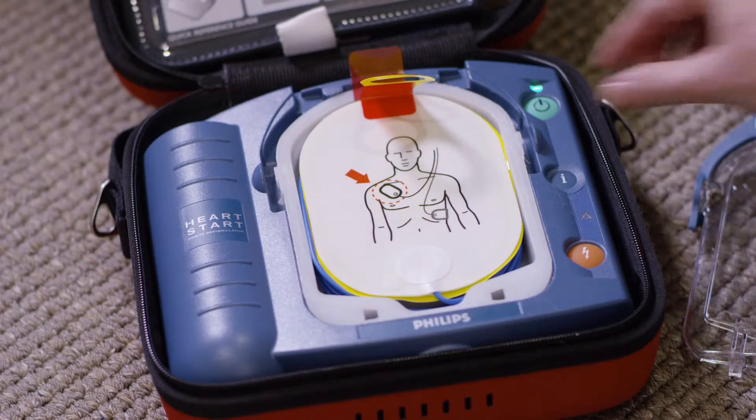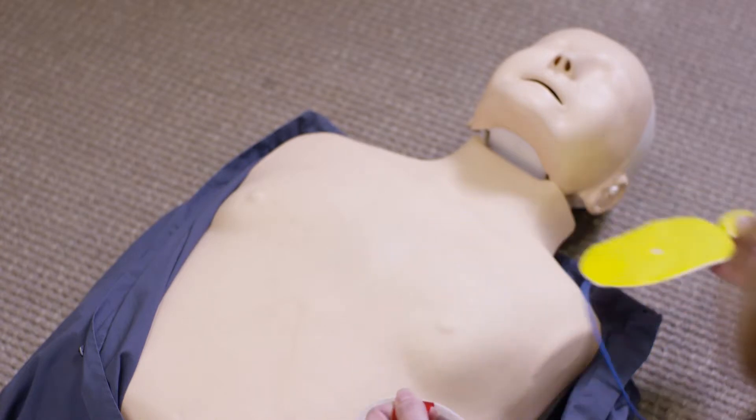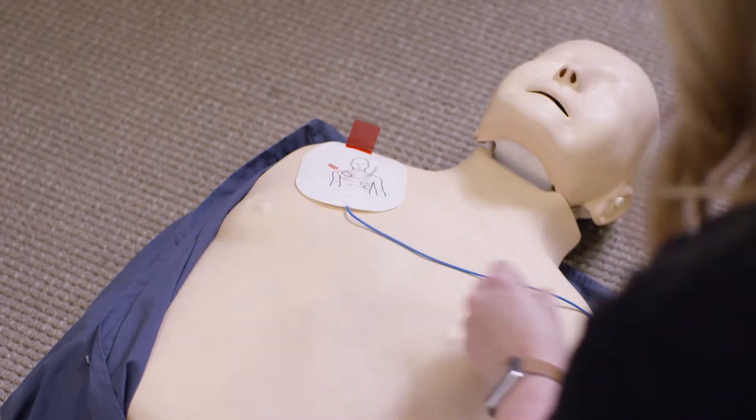Look carefully at the pictures on the white adhesive pads. Peel one pad from the yellow plastic liner. Place the pad exactly as shown in the picture, and press firmly to the patient's bare skin.